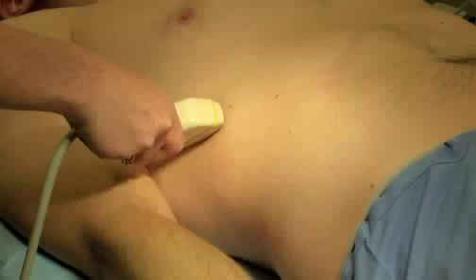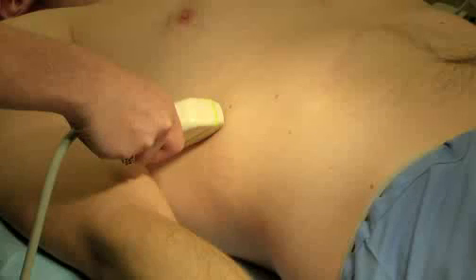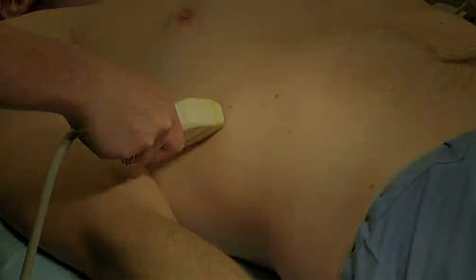If the gallbladder is still too cephalad to see adequately, consider moving the probe to an intercostal position at the 7th or 8th intercostal space, with the marker pointing towards the right axilla. In this position, the liver is used as an acoustic window to avoid bowel gas. However, this may limit your exam due to rib shadowing and will eliminate the sonographic Murphy's sign.